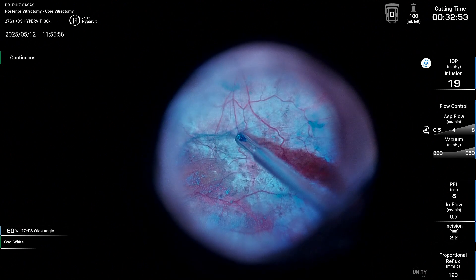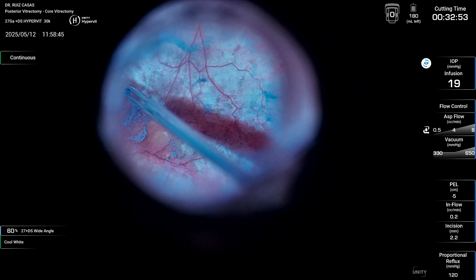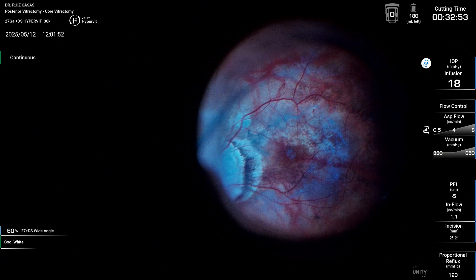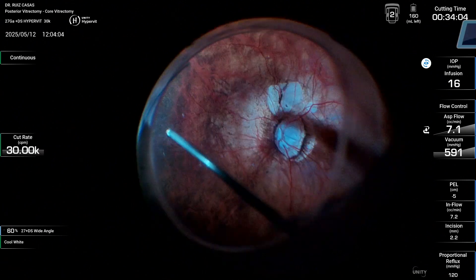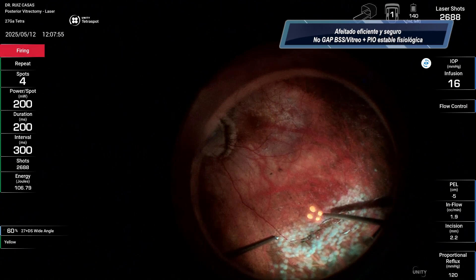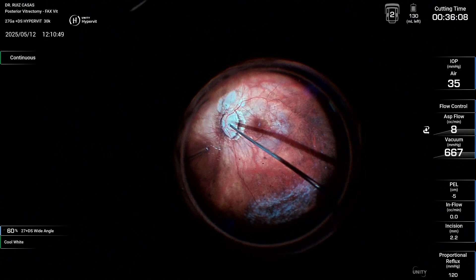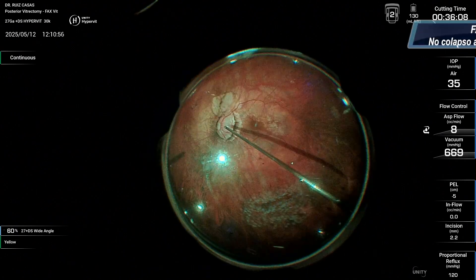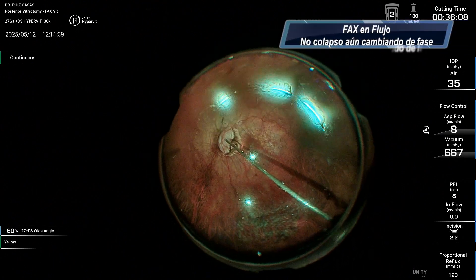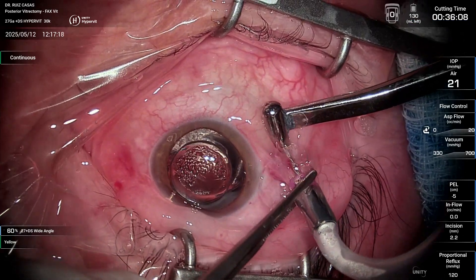The Ingenuity system in this case allowed me to have superb visualization of the posterior pole. I'm not so keen on using 3D systems, but certainly this new software and the combination with the Unity system are a step forward. These were my two first experiences with the system and I think this is clearly a game changer in the vitreoretinal world.